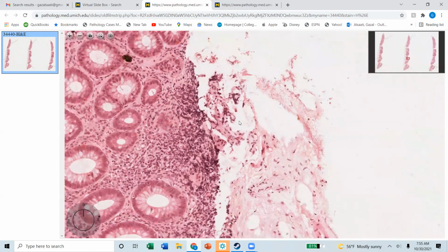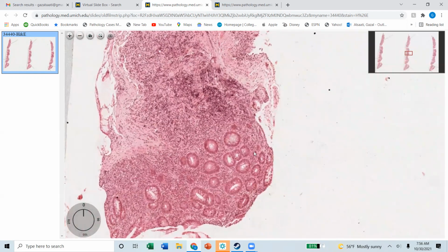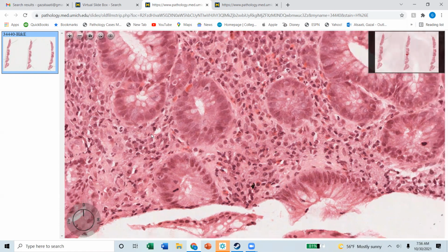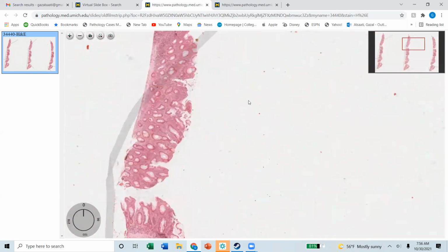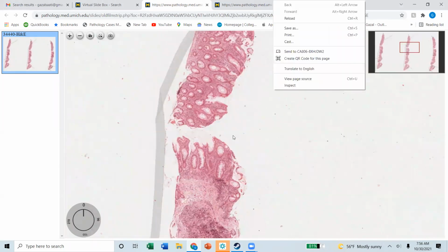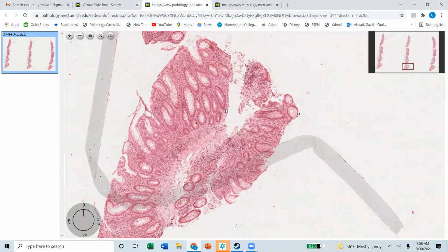Now you want to see the severity. You want to make sure that this is mild, moderate, or severe. Okay, this is very subjective, and there are not strict criteria to call it. Here's a nice cryptitis. Not a nice criteria, but I will look at all my pieces like that. And for me, I would say, okay, this is involved. All the pieces are involved. Probably this is not as involved with activity. So I will call this moderate.